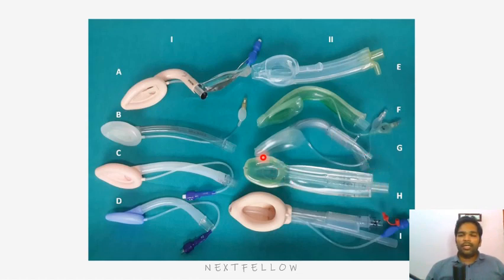And this you can easily identify by the gel-like material in the front. So don't confuse the Baska mask with the i-gel. In the i-gel, we have a gel-like material in place of the cuff, which will expand to the temperature of the patient and engulf the larynx. So this is the i-gel LMA. Here two tubes are there, one for the esophagus, one for the trachea, and we have a gastric decompression port and an armored tube. So this is the ProSeal LMA. Just remember all these pictures, and if you are able to remember some salient points, that is well and good.